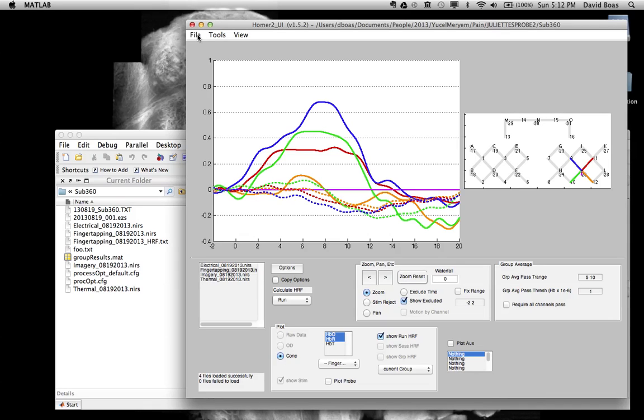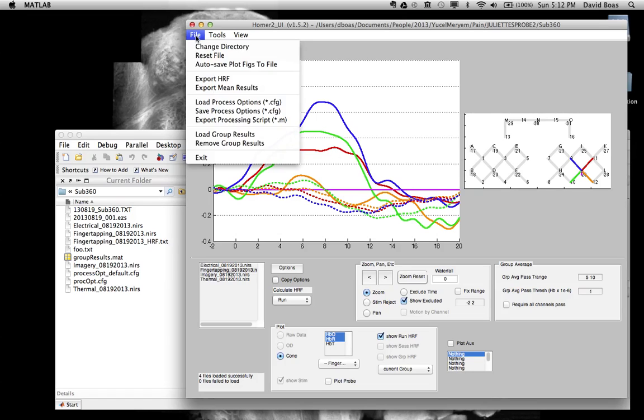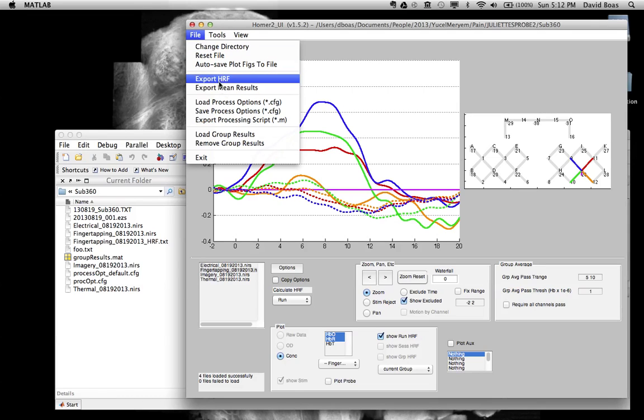There are two ways to export the hemodynamic response function that's estimated by Homer. You can do it with the file menu using these menu items.